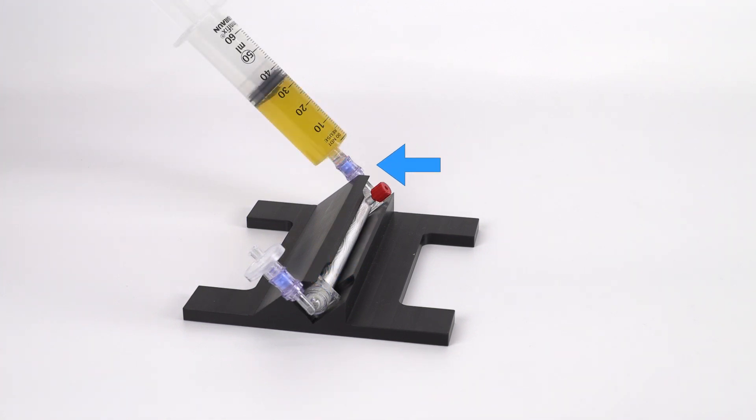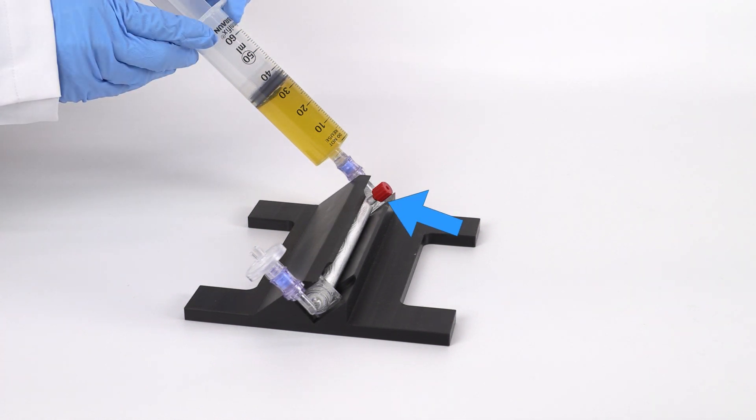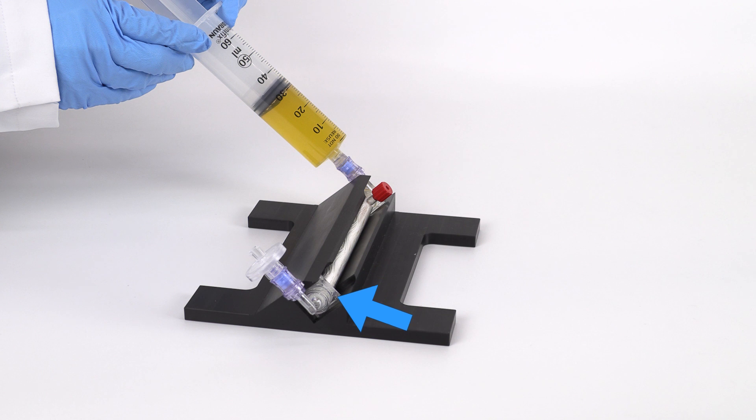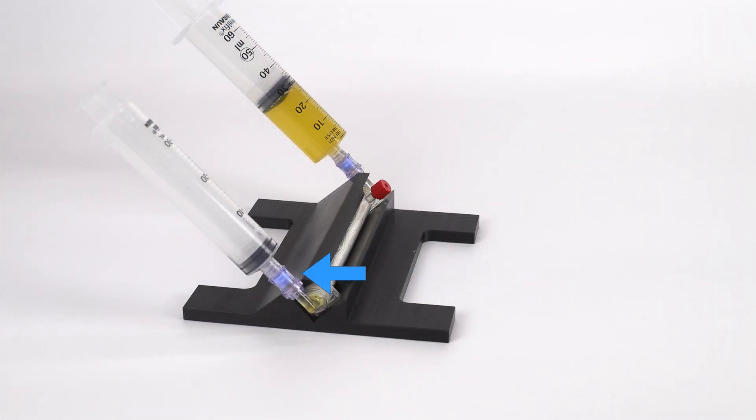Remove the red cap on the opposite end port and attach the plasma syringe. Inject plasma through the device until it reaches the filter. Remove the filter and attach an empty transfer syringe.